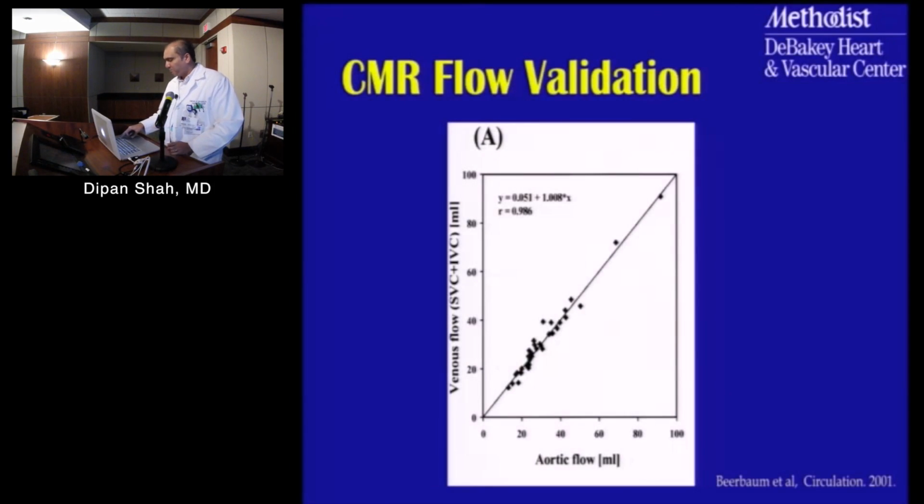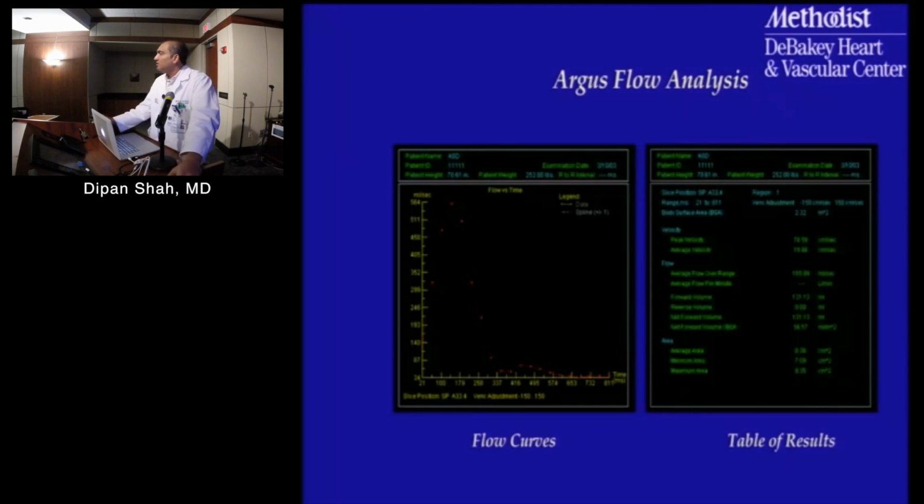Now, how good are these measurements? Anything, let's say, if you're at the sinotubular junction. Right, coronary flow. See that coronary flow? Yeah. So sometimes you'll see a slight little negative blip at the very, very onset of diastole. A few cc's, and that's your coronary reverse flow.